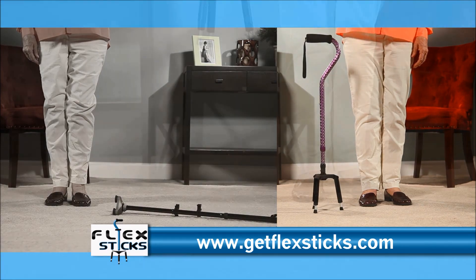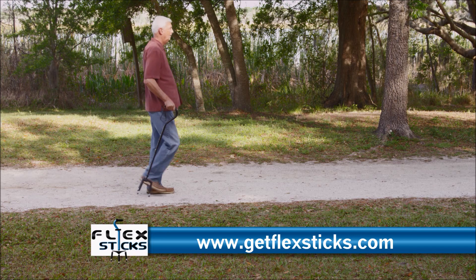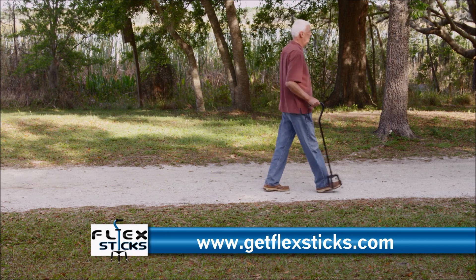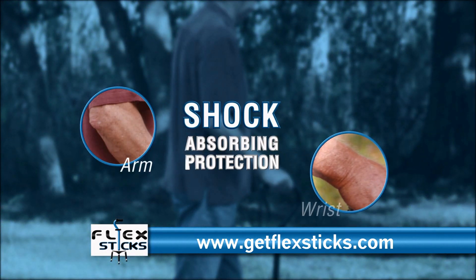And only FlexStick can withstand the drop test, absorbing the shock and always standing by you. Even when you're just taking a walk on a flat surface, FlexStick's shock-absorbing design alleviates much of the stress on your arm, wrist, and shoulder.